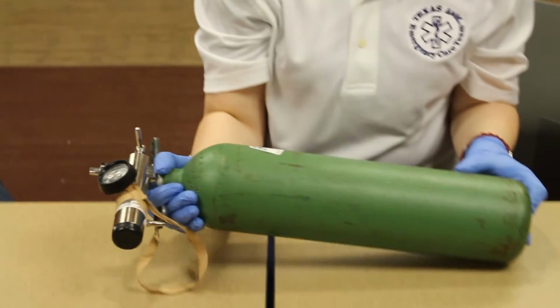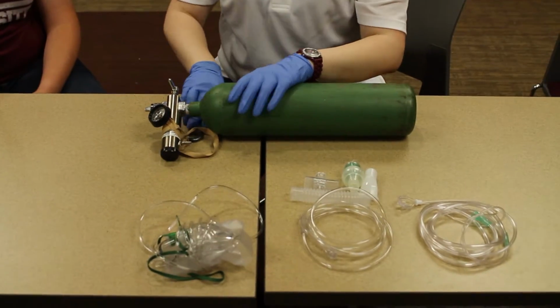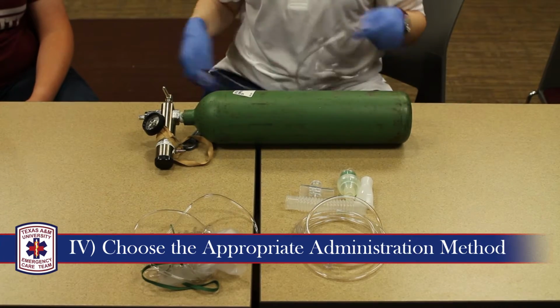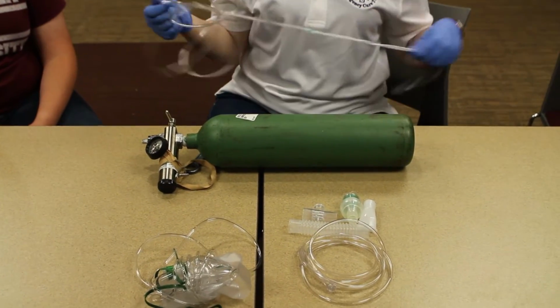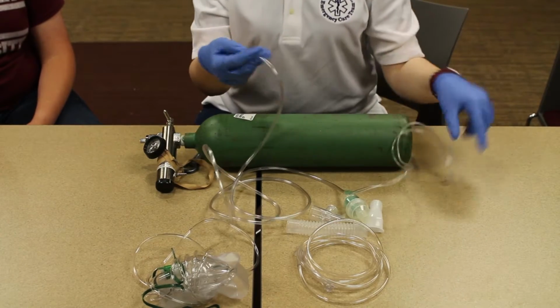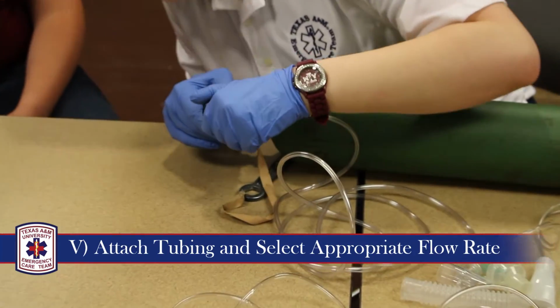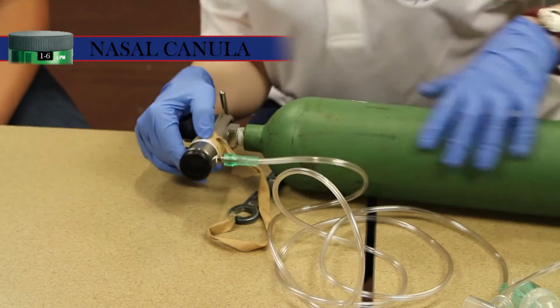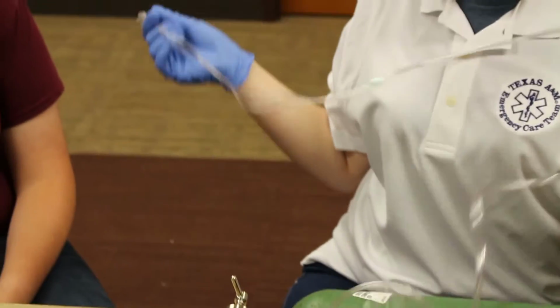Lay the oxygen tank back down on its side and select the appropriate administration apparatus. First, we will take a look at the nasal cannula method, which is used to administer low-flow oxygen. Attach the tubing to the regulator and select the appropriate flow rate, which for a nasal cannula is from 1 liter per minute to 6 liters per minute.